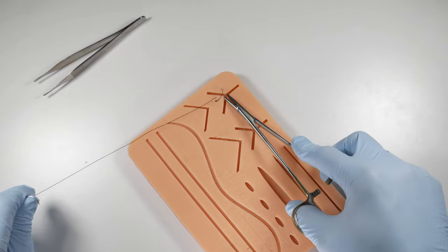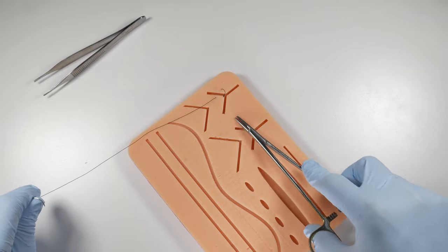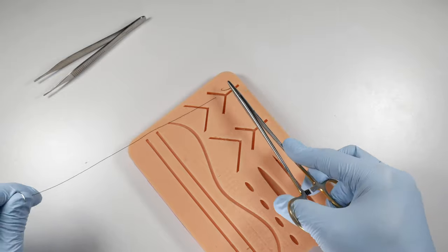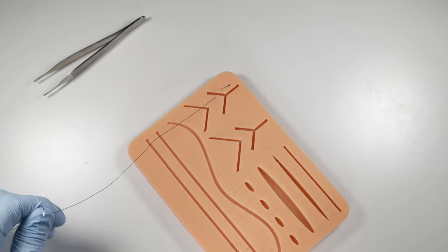That keeps it free from all the saliva and sticking to the tissues or the tongue. Sometimes if you don't do this, this suture tail is going to find itself somewhere and be stuck there and it's a little bit tougher to grab. So it's easier to grab it from the surgical suction than it is from other sites in the mouth.